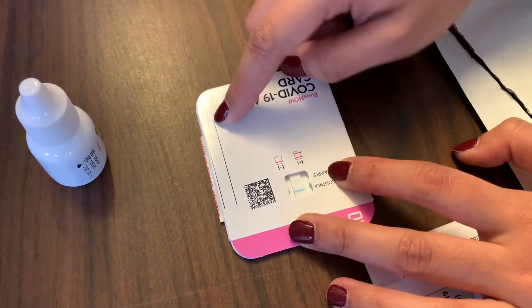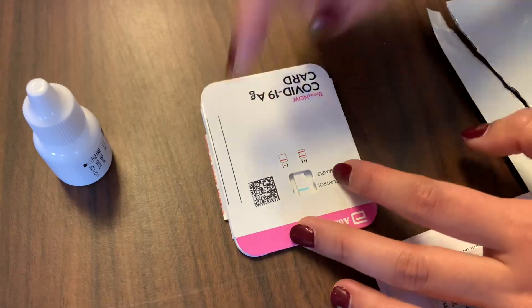Then write your name, the date, and the time, and start a 15-minute timer.